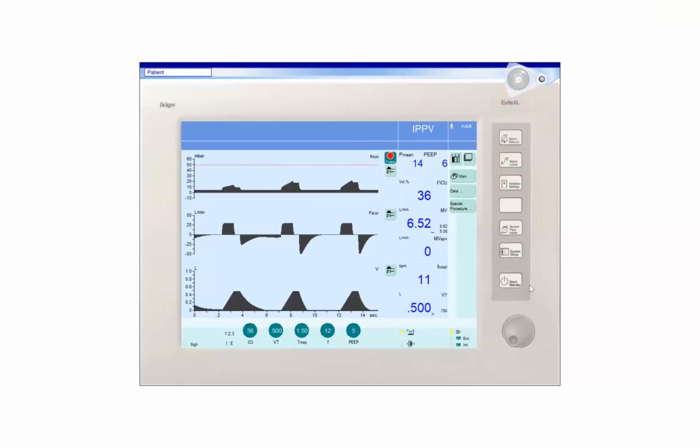Okay, so we can see that in the second breath there is increase in both the peak airway pressure and plateau pressure. Excellent. Also, which indicates that there is an issue with the lung compliance. Okay, so there is increase in the peak pressure and the plateau pressure without increase in the airway resistance. You can see the difference between the peak pressure and the plateau pressure is still the same. So that indicates that the problem is either in the lungs or in the chest wall, right?